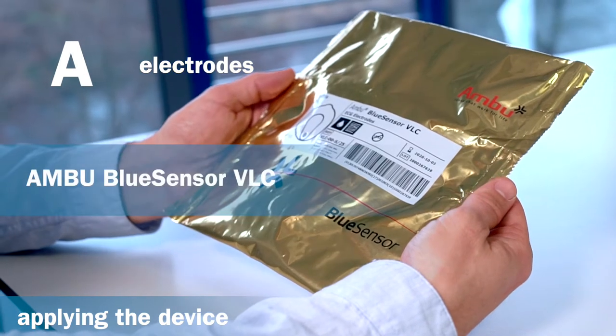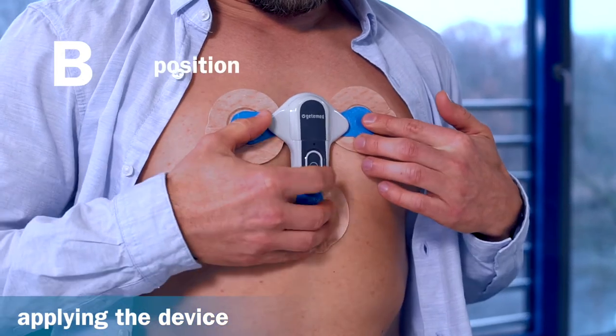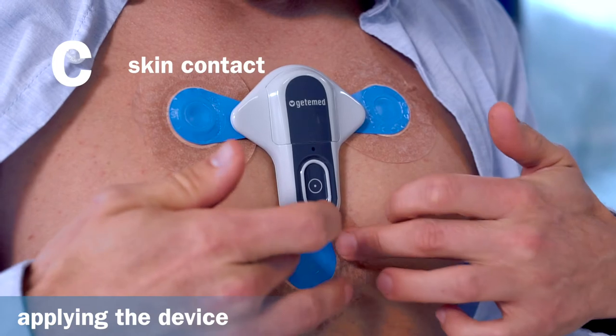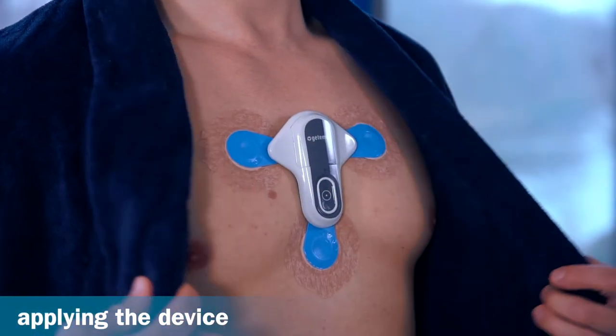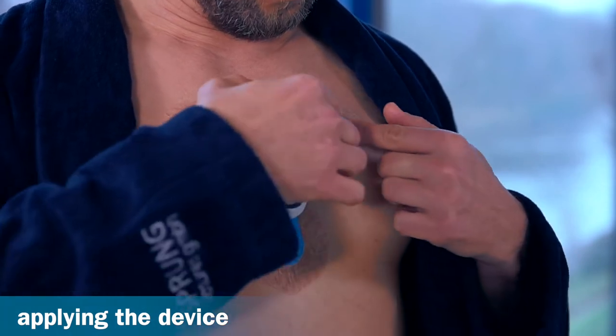Here we recommend the Ambu Blue Sensor VLC. To find the best position on the patient's chest, and to press the electrodes firmly. For best performance, chest hair should be carefully removed before attaching the electrodes.